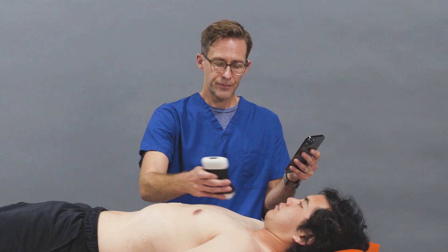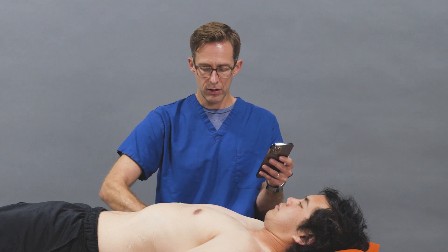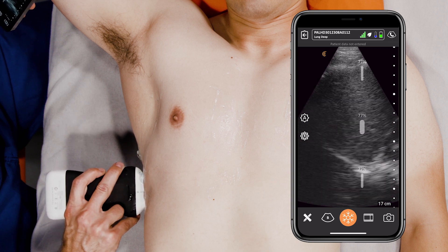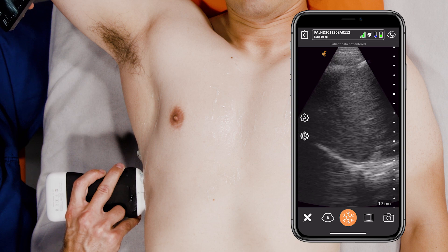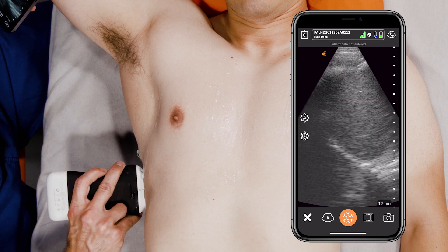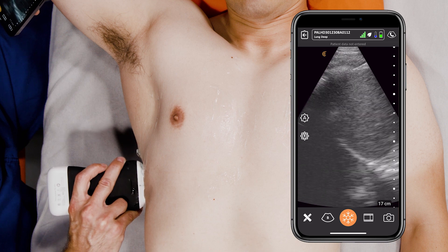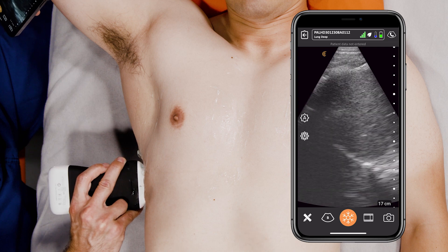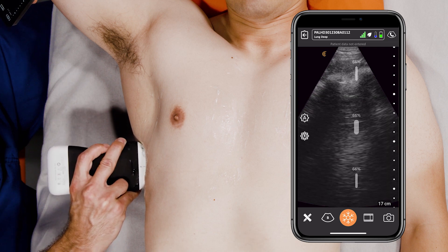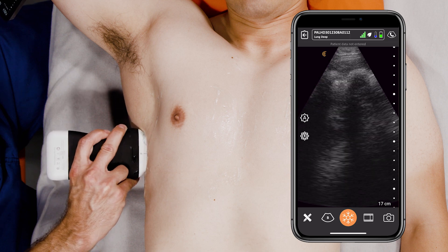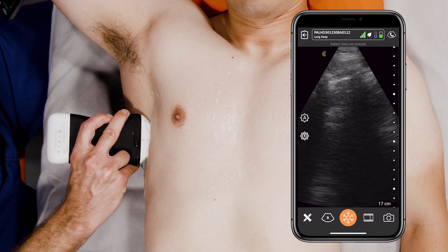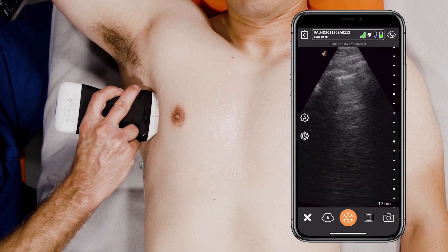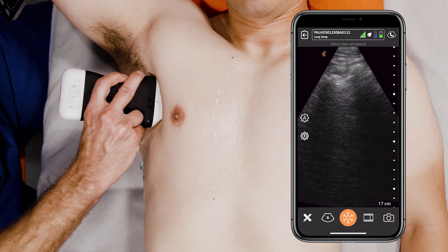After the anterior, we go laterally. I kind of start towards the feet because I want to see the liver — there's your liver, turning up the gain — and then there's the diaphragm, moving with respiratory variation. Often right here is where we're going to see a pleural effusion. Then you move up the lateral aspect, looking for A lines and making sure you see no pulmonary edema or consolidation. Just go as far as you can.